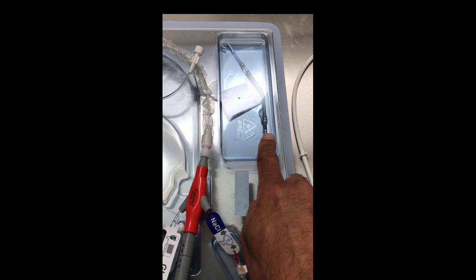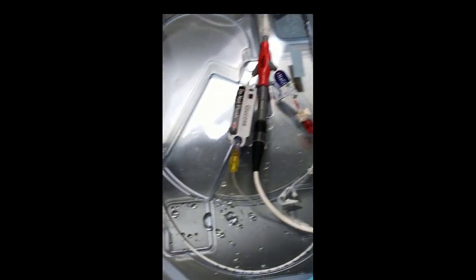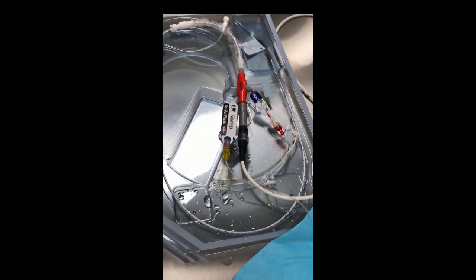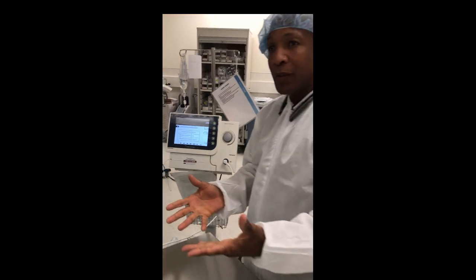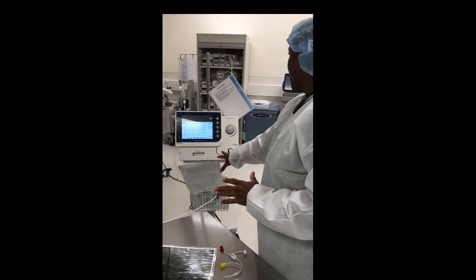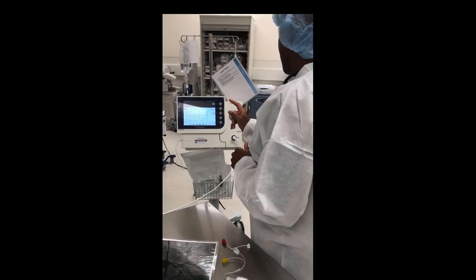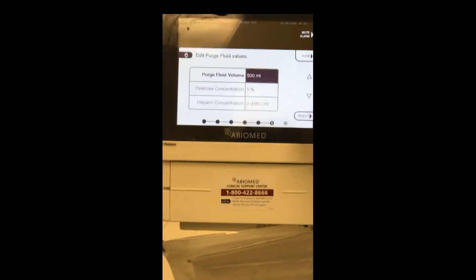It's set up. Believe it or not, you just set this up. Notice how the console walked you through without me being here — you connected all the components on the sterile field. Now it's literally ready to go into the patient's body, but the computer wants to know how big a bag you hung. Hit 'edit' and let's change it to 1000 ml.